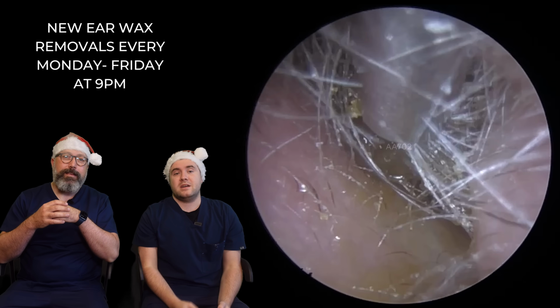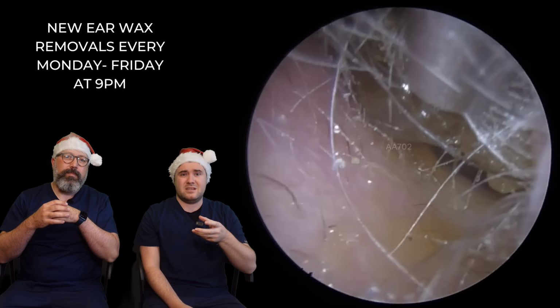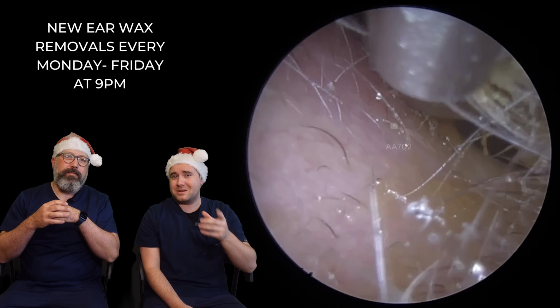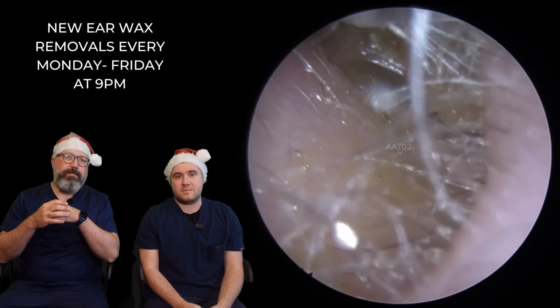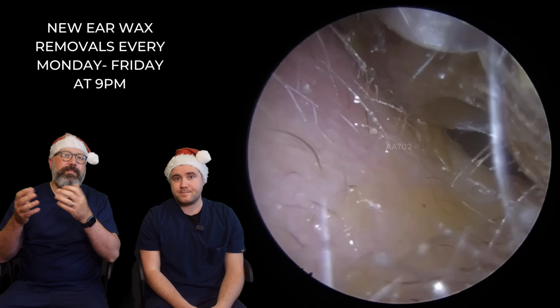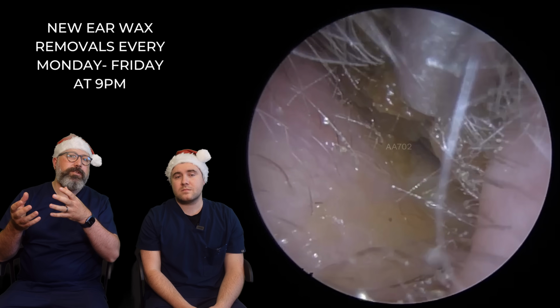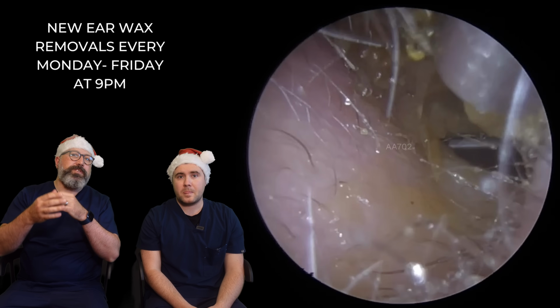Right. And also if we were to remove those hairs, that's another appointment altogether that we would be taking up. That'll probably take us quite a while. Yeah. But we wouldn't do it anyway. It stays in there. It's there for a reason. I think for a rule of thumb with me, obviously, if we can see what we're doing and we're not putting the patient at risk at all, we would leave them in there and we just sort of pull it out. Yeah. It's not causing us any issues here.